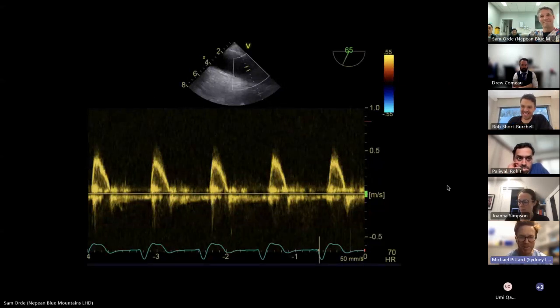I'd like a pulse wave Doppler in the descending aorta. So this is a pulse wave Doppler in probably the descending aorta. Yeah, descending. Sorry, I should have said that. Yep. 2-chamber. Oh, sorry, a long axis view. So this demonstrates some diastolic flow, but I don't think it's greater than 0.2 meters per second. So I don't think that this is consistent with severe regurgitation.